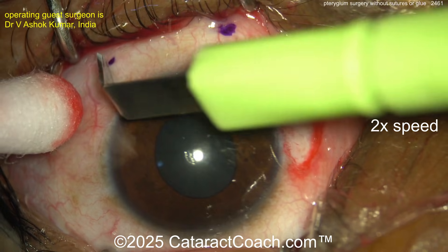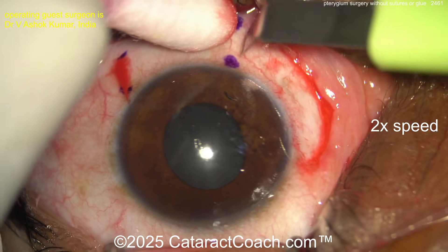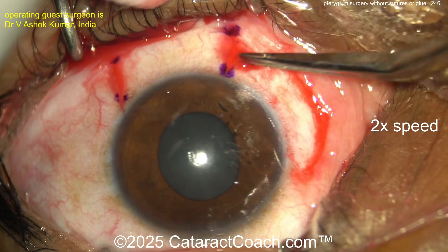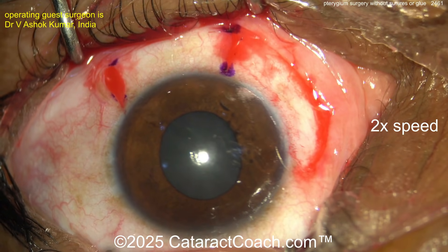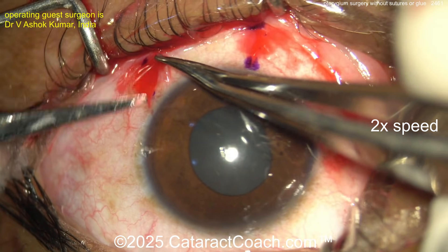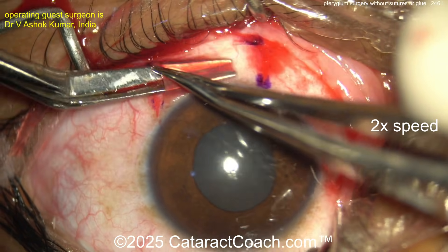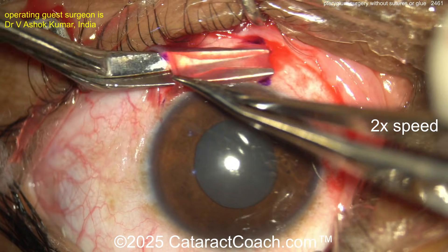Using a crescent blade, very gently, just to incise the conjunctiva — very superficial. Then some dissection using the Westcott scissors — gentle dissection. You just want the conjunctiva, not the Tenon's. You can also inject underneath with lidocaine with epi to help dissect it out, but here we have beautiful manual dissection, very superficial. That looks great.